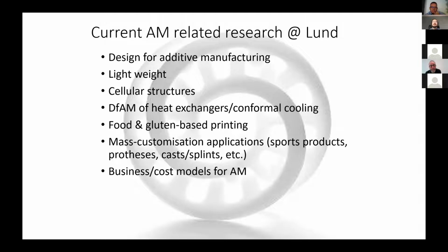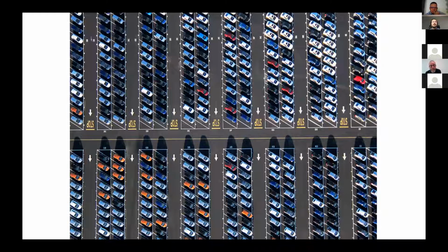And of course, mass customization for prosthesis, but also furniture and other applications for this technology. And then we also do some strange stuff like printing food and gluten-based printing as a sort of side project at the lab.